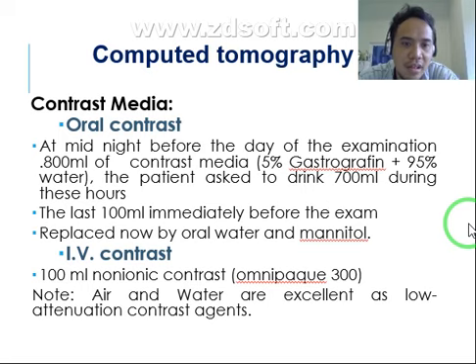So for IV contrast, 100 ml of non-ionic contrast media is preferred to be used like Omnipaque or Ultravist, pwede na to siya gamiton nga contrast agent. Okay? Pag non-ionic man gud, non-reactive man gud just for allergic reaction. So mao na ginagamit. Note that air and water are excellent as low attenuation contrast agent.